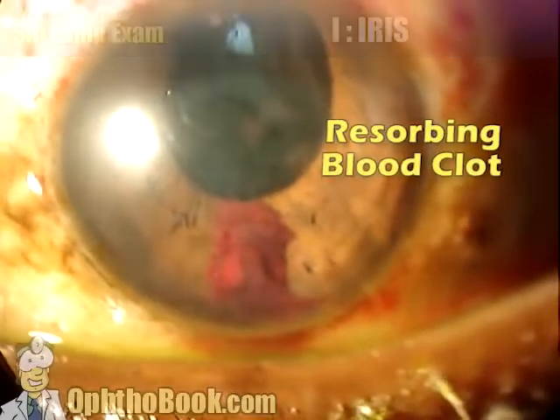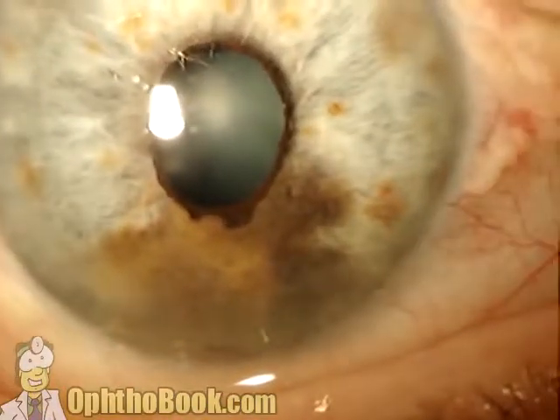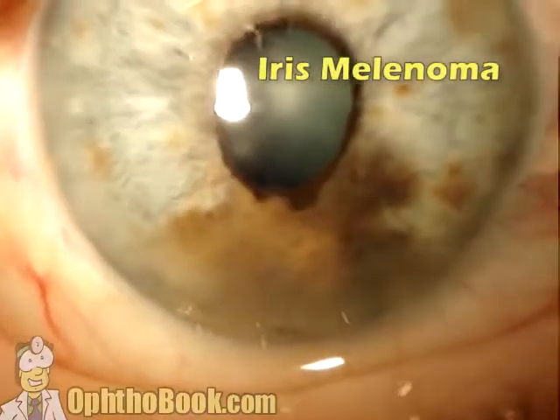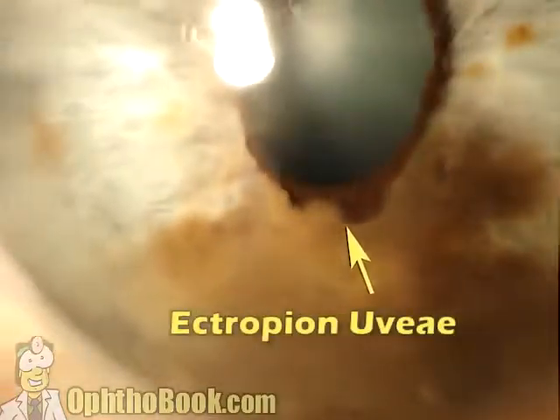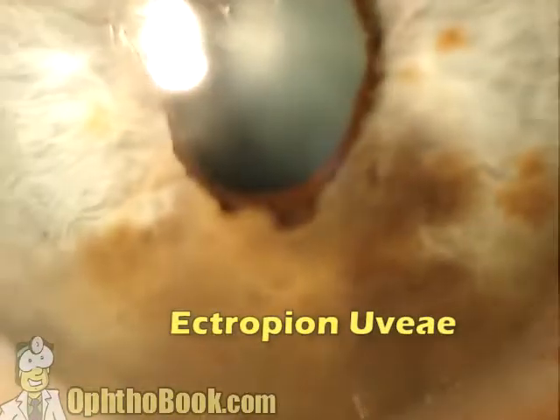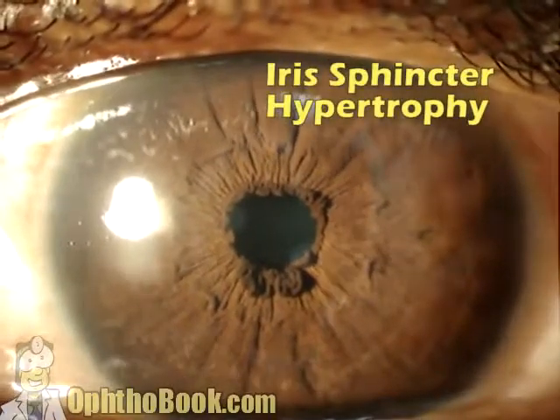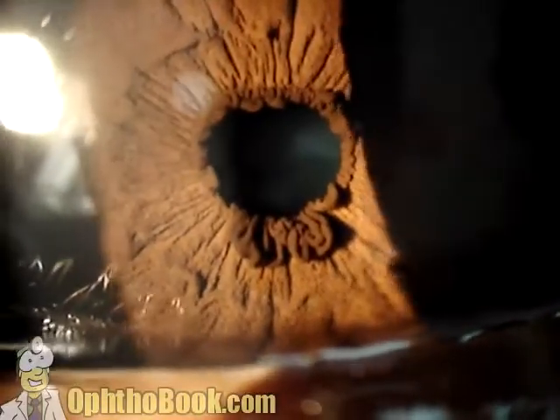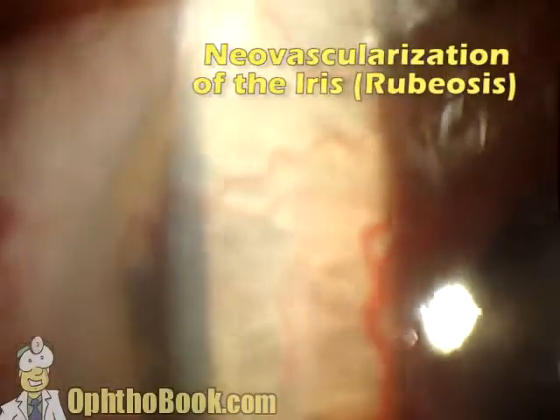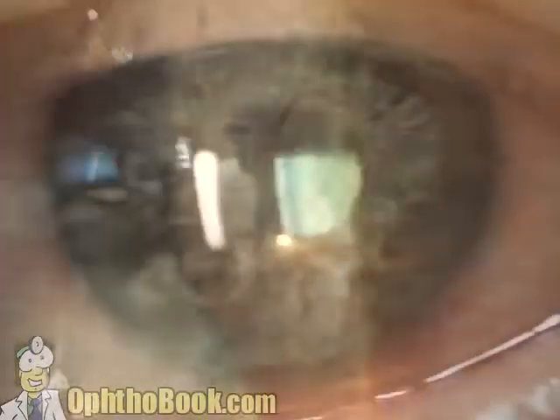This is a resolving clot on the surface of the iris — what we always worry about with bleeding in the eye, because on days three to five the clot starts to resorb and you can get a re-bleed. This is a melanoma on the surface of the iris — if you look closely you'll see a pigmented ridge on the bottom edge of the pupil. This is ectropion uvei, where the back of the iris is being pulled forward through the pupil onto the front of the eye from contraction of the cancer. This is hypertrophy of the sphincter muscle controlling pupil constriction. Here's neovascularization of the iris — we always worry about this with diabetic patients; it's one of our pertinent negatives.